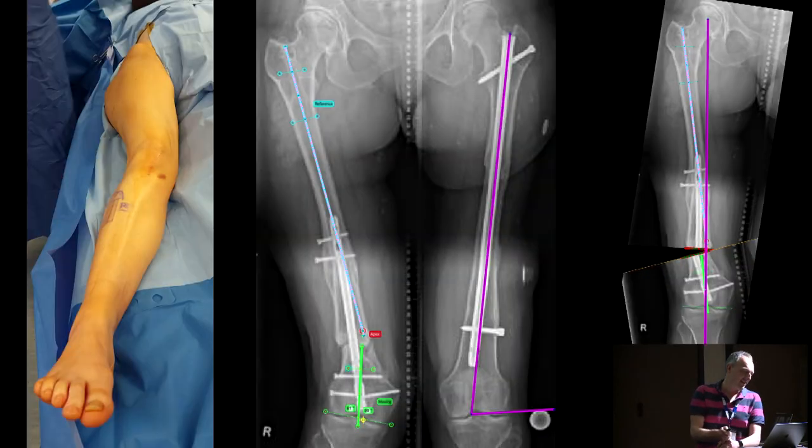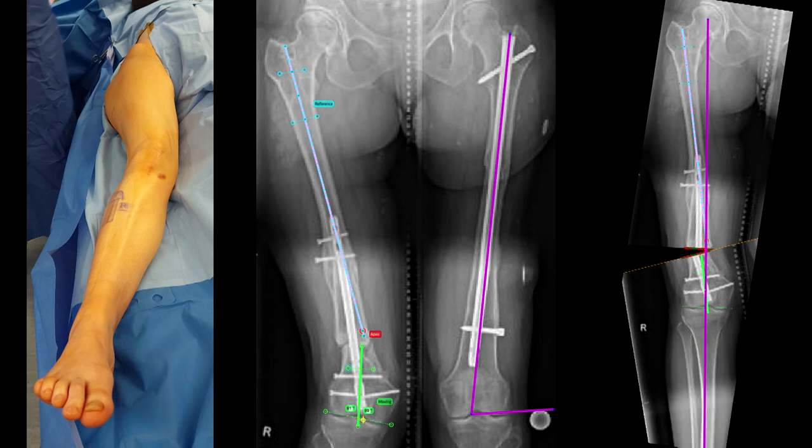So only at that point do I come onto the operation. Here we can see this is the young lady's leg. She's prepped and draped on the table, radiolucent table, plan up on the wall, exactly as people have said. I think it's really important you write the steps down. It's easy to forget things.